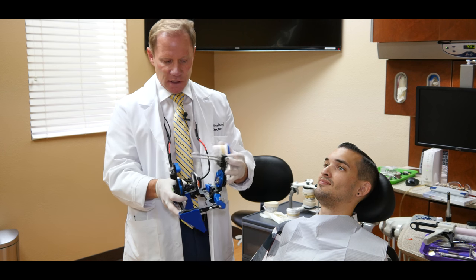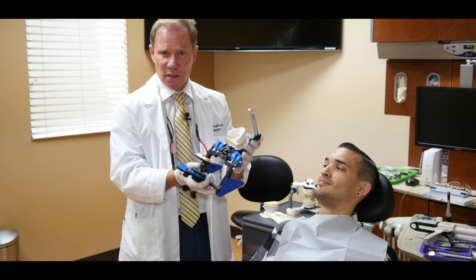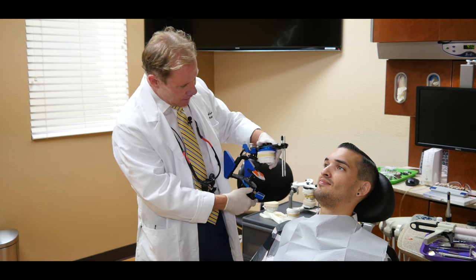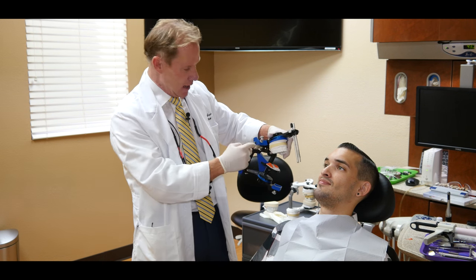So now we have this very accurate, not only horizontal but vertical, representation of Jake's arch, but it also gives us a very accurate relationship between his teeth and the hinge axis.